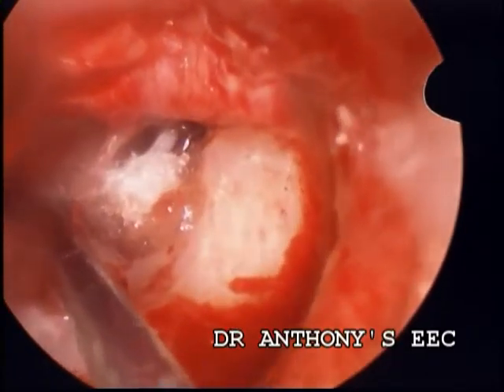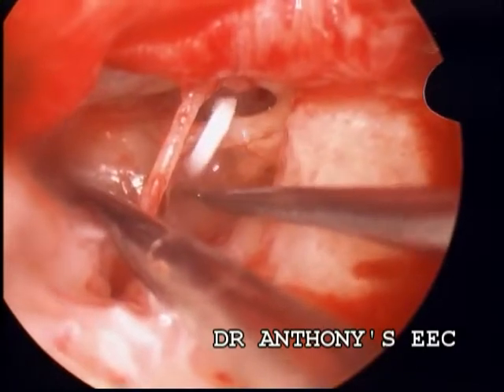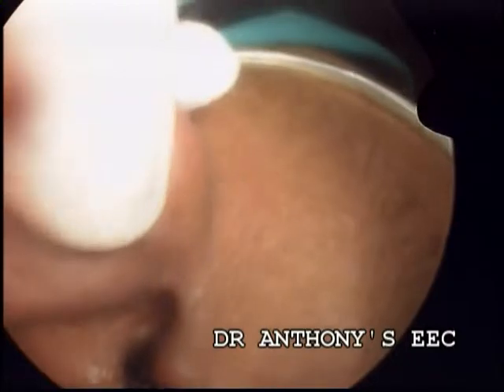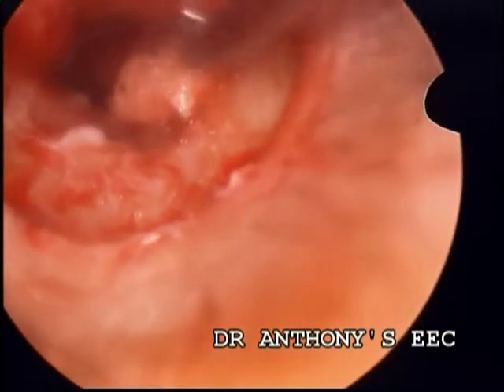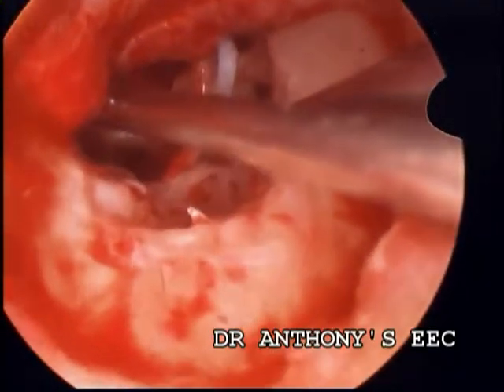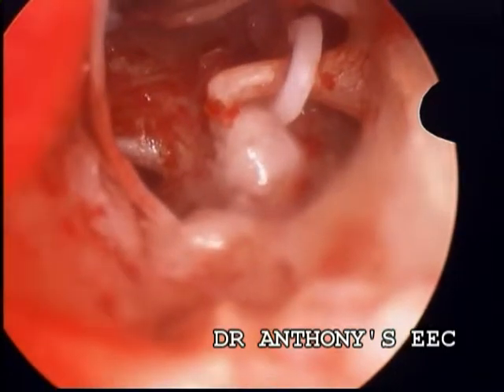I tried to seal the gusher with a bit of gel foam. You can see the fluid lifts the gel foam. So I wanted to seal the gusher with fat. I took out the fat graft and kept it in place while continuously sucking the fluid. The area was packed with fat; the regular stapedectomy status is completed with fat kept in place.